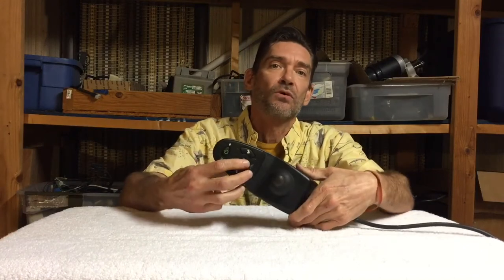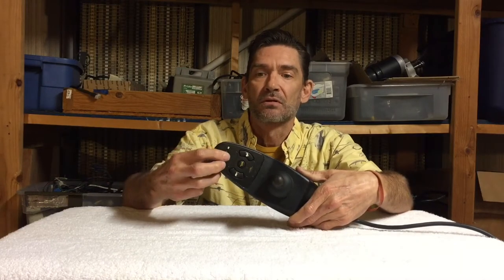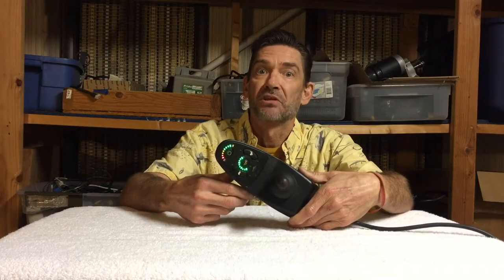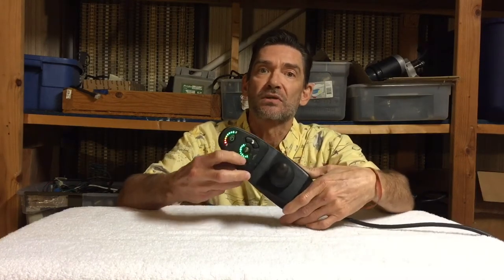Alright, so let's turn it on again. This is how you do it: you turn it on and within two seconds you hit the horn button twice - do do - and that should unlock it. Let's see if that works. One, two... yep, that worked. It's all ready to go now.